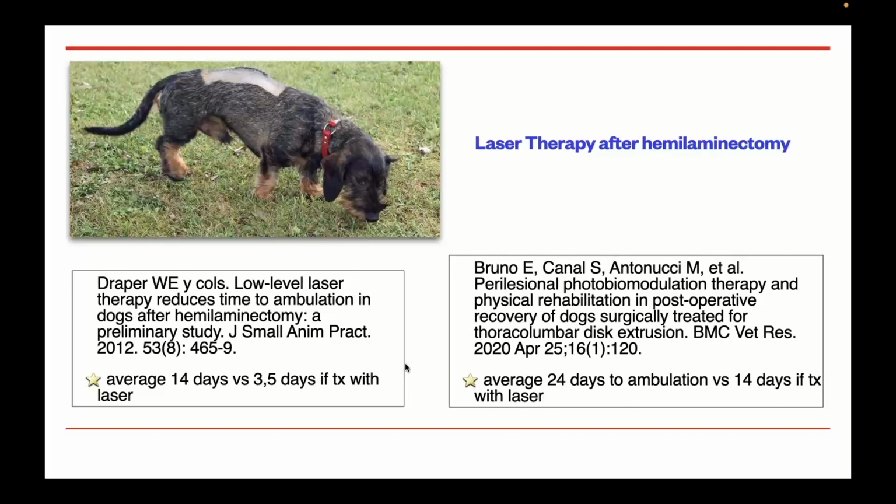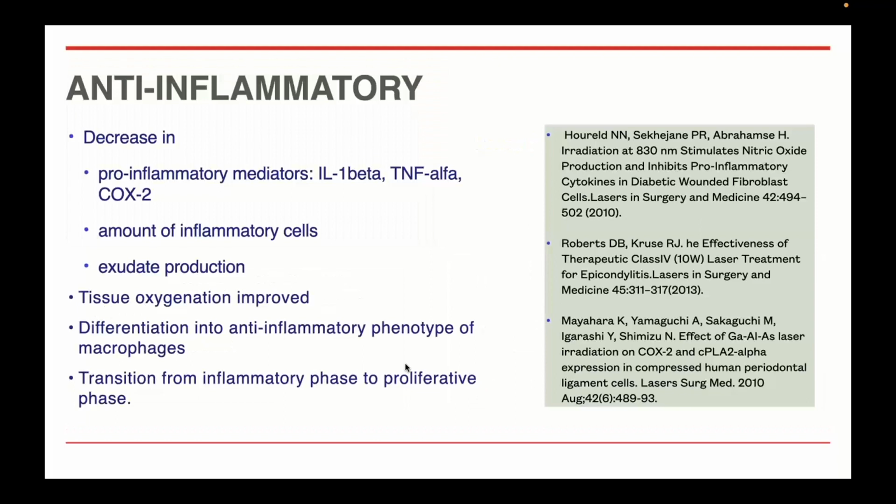This improvement we see in patients after hemilaminectomy and with the conservative approach as well is probably due, at least in part, to the anti-inflammatory effect of the laser therapy. After wound healing, it's the most studied and reported effect of laser, the anti-inflammatory. What studies tell us very consistently is that laser therapy decreases the production of most pro-inflammatory mediators.